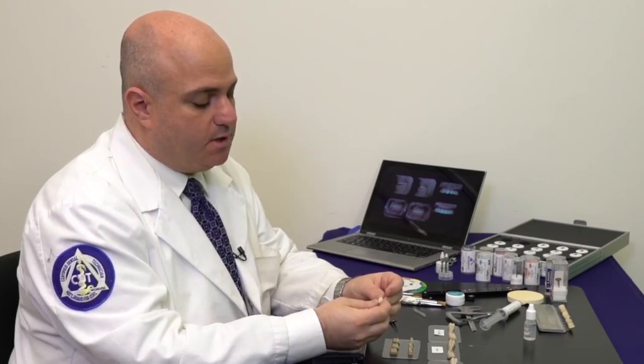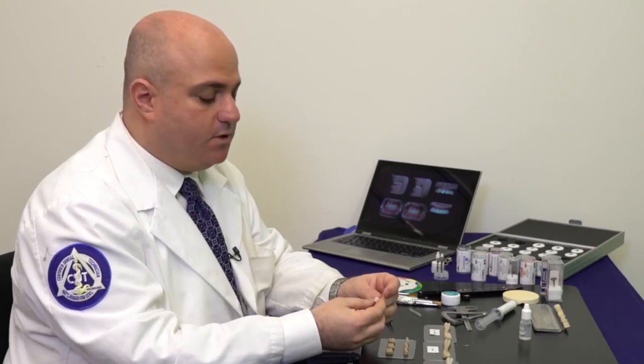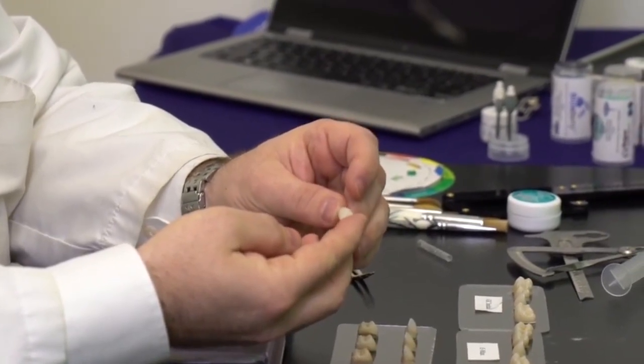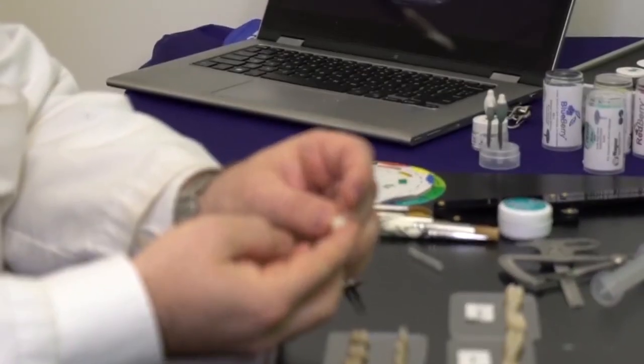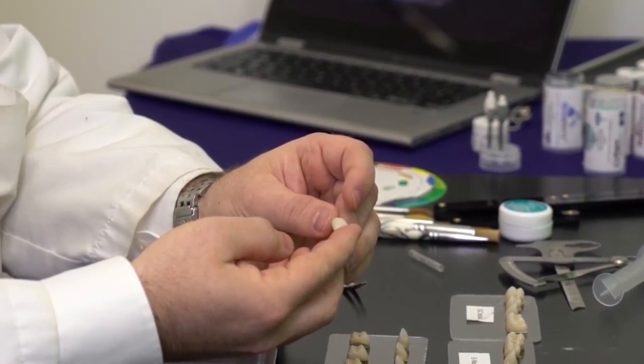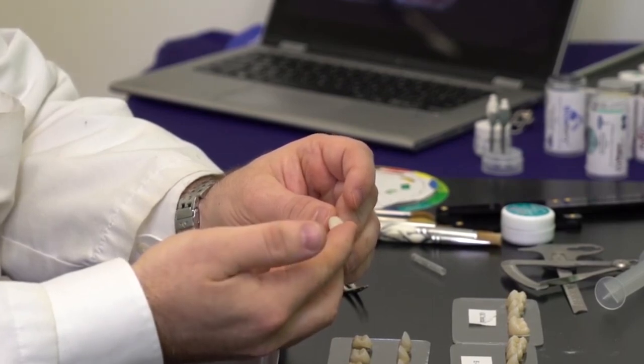For example, this may be an A3.5 with perhaps an A2 mill on top of it, and you can see that right away on the cervical it really warms up the restoration — and that's prior to putting anything on it. All it is is milled and then sintered. So now we're ready to go ahead and post-process where we're going to stain and glaze.